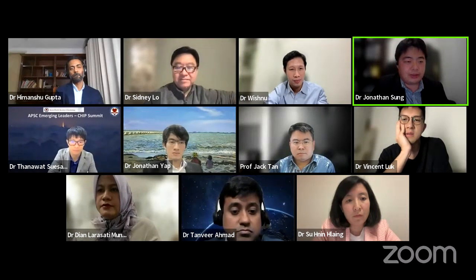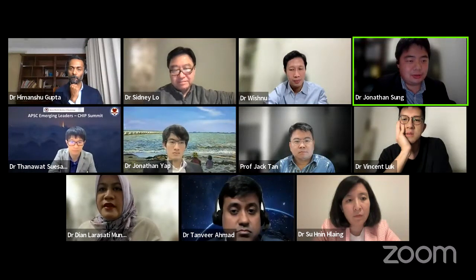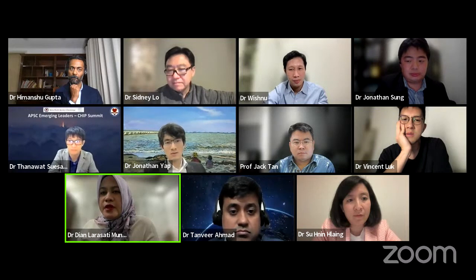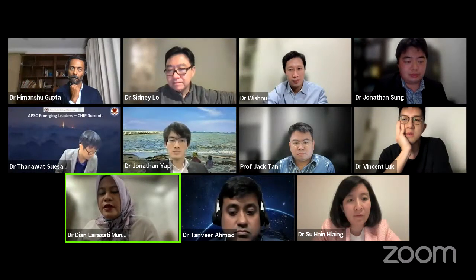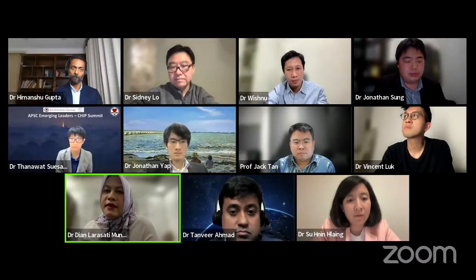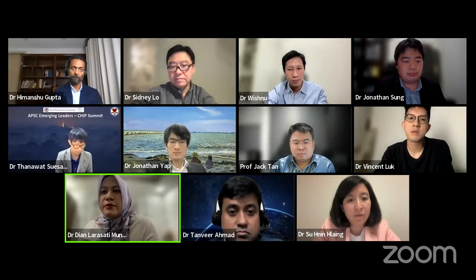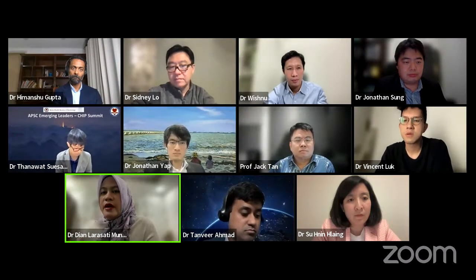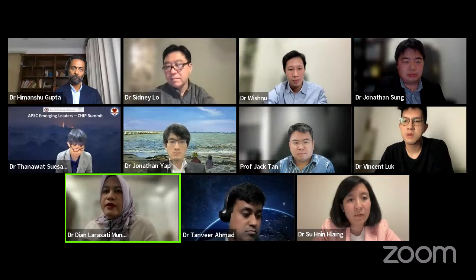Yeah. And now one last comment from Deanne. Yeah, thank you, doctor. What I want to say is that not only for the strategy for choosing whether it's rotational atherectomy or OAS, I think the most important thing is to choose the balloon after we put the rotational atherectomy. I think in my experience, the combination of rotational atherectomy and cutting balloon is better than scoring or even the NC balloon.